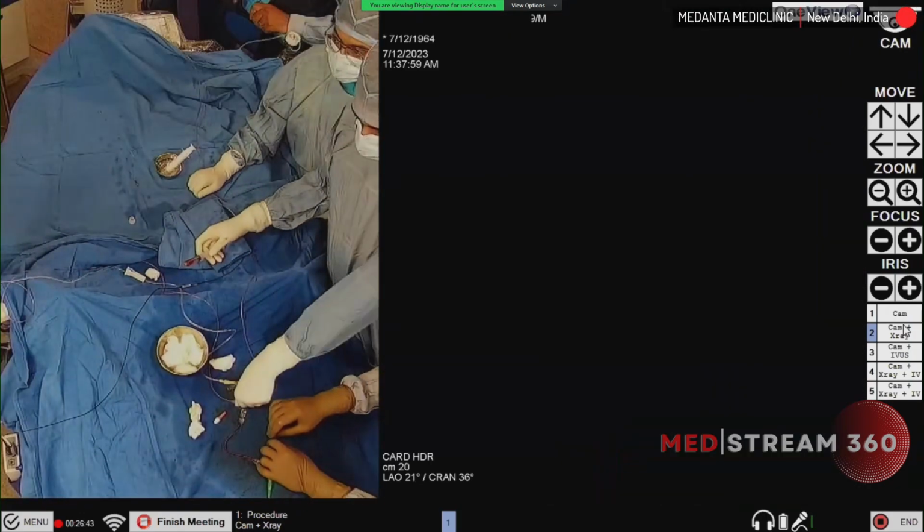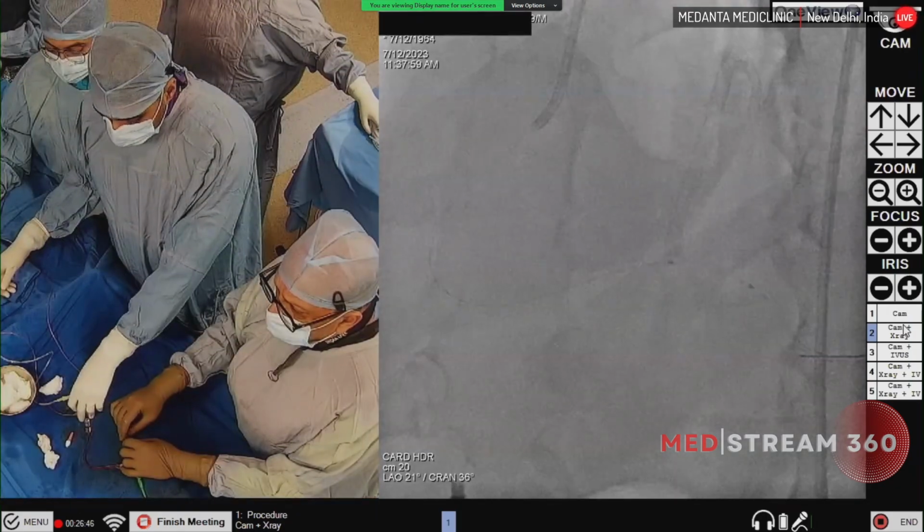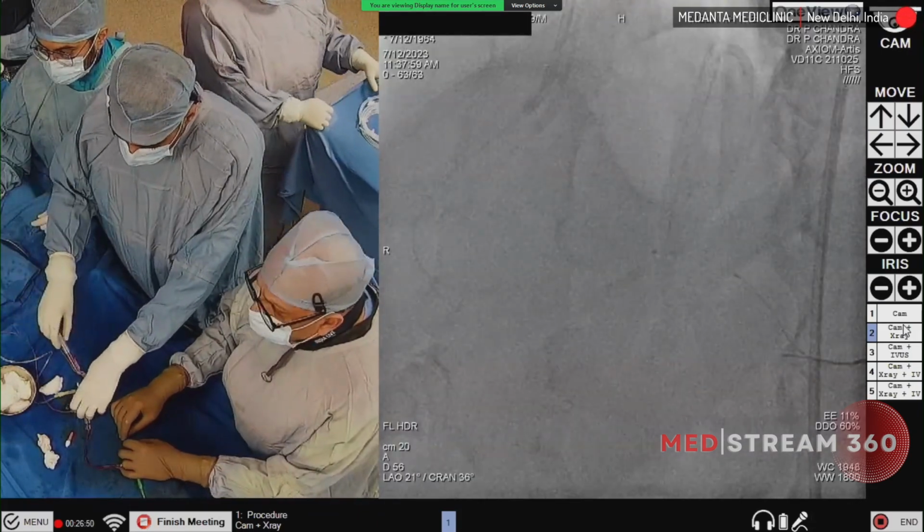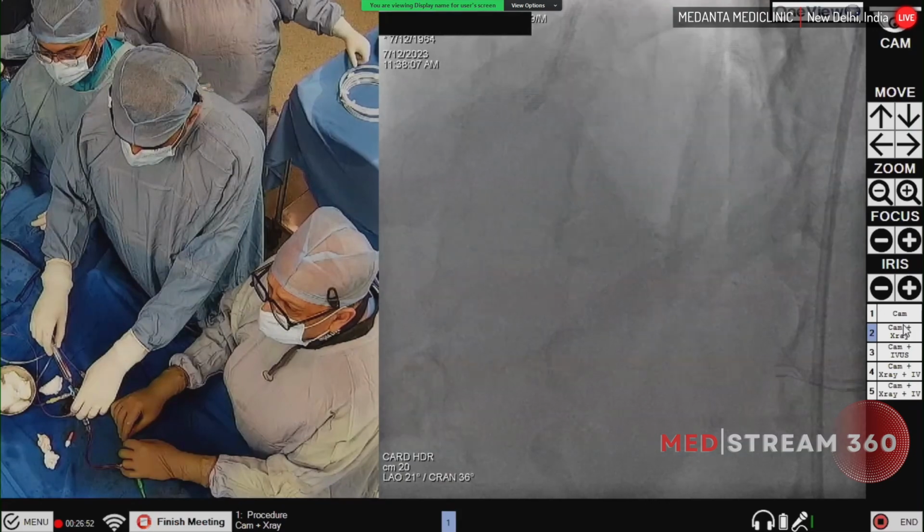Pressure, please. Show the pressure always. Okay, deflate. I will check a little bit. Check. Air is there in that guide. Check.